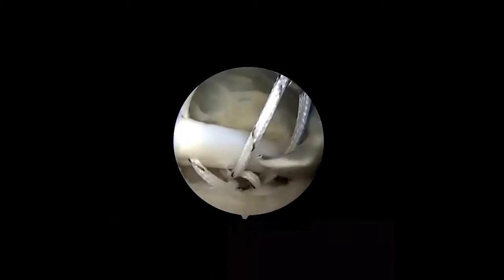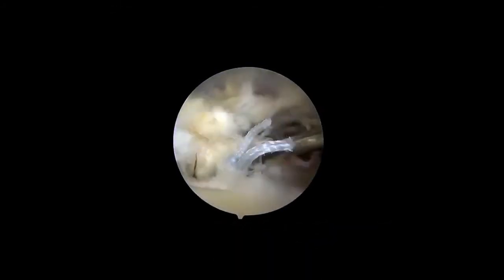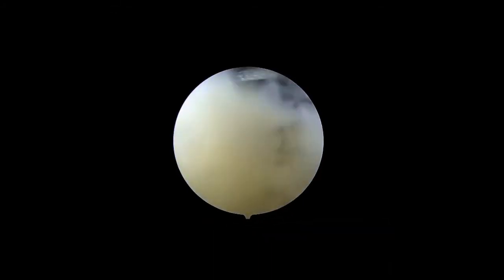Additional stitches were used, one proximally used for proximal biceps tenodesis by using a Mason Allen stitch and later passed obliquely and tied in such a fashion. Distally within the groove, a second suture from the distal row was taken and fixed the biceps in place, achieving a double row technique. Furthermore, one proximal and medial anchor suture for better application of the tendon over the bone tendon interface. Also, one suture from the distal anchor for anterior dog ears, and another one distal posterior for posterior dog ears.